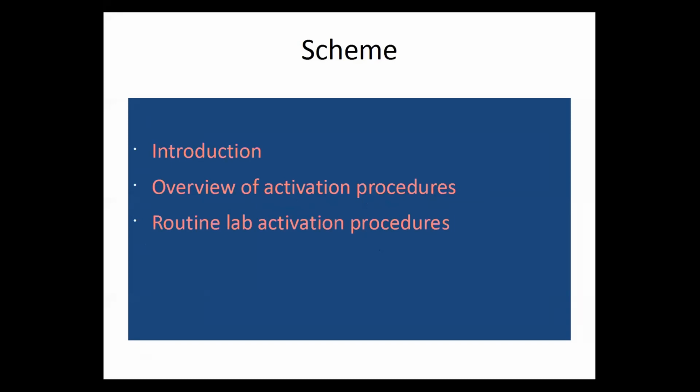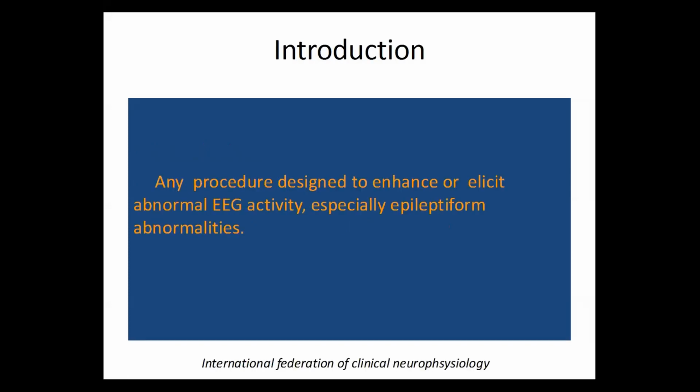Today we'll go through an introduction to the activation procedures, an overview of the various activation procedures, and discuss a few routine lab activation procedures. Any procedure which is designed to enhance or elicit abnormal EEG activity, especially epileptiform abnormalities.